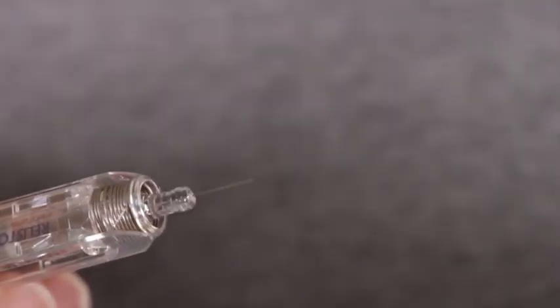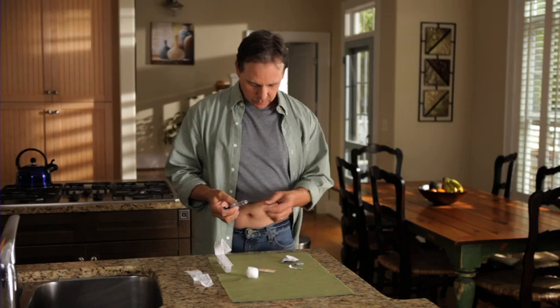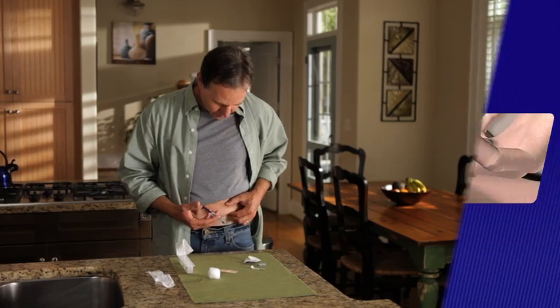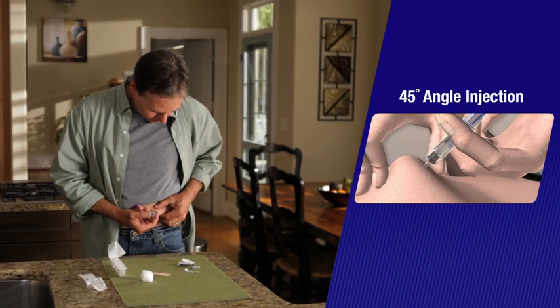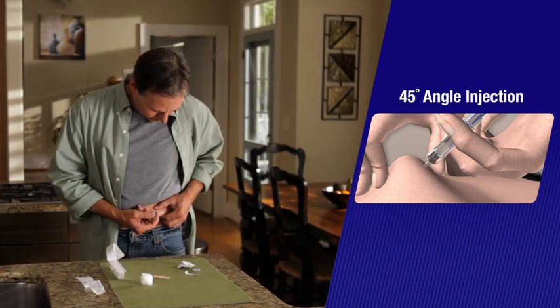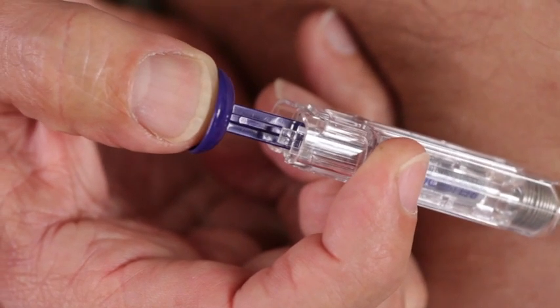Now, firmly hold the barrel of the pre-filled syringe and pull the needle cap straight off. You should not touch it or allow it to touch any surface. Pinch up the skin around the injection site. And now insert the full length of the needle into the skin at a 45-degree angle with a smooth and quick dart-like motion.